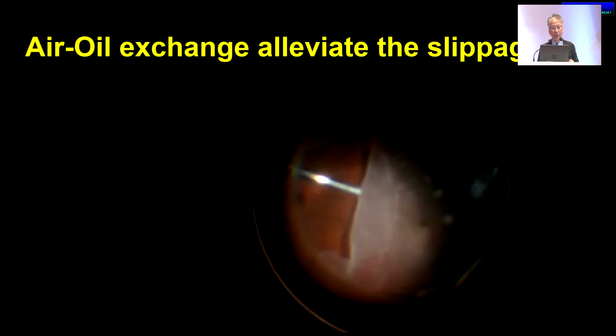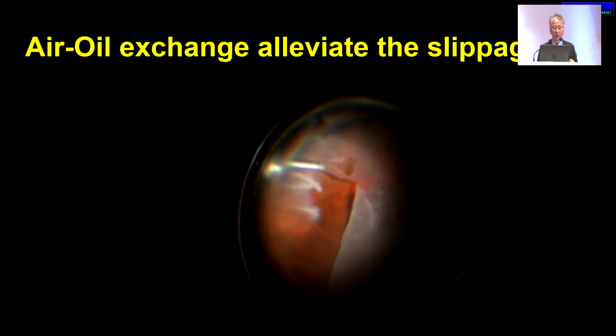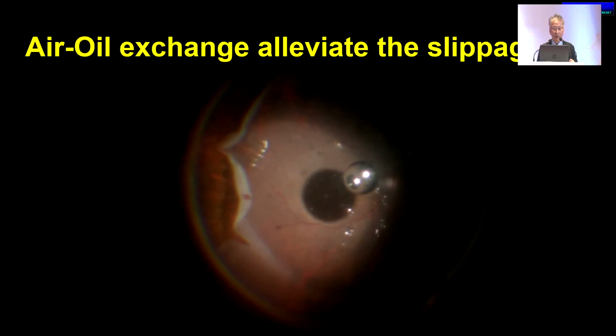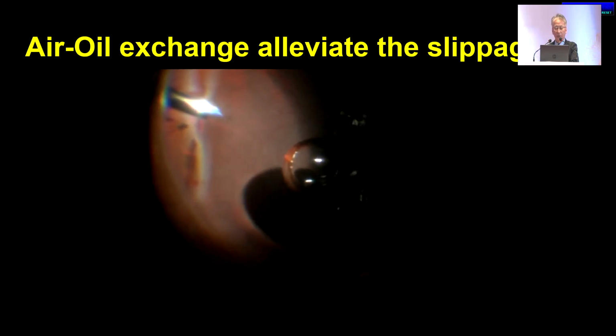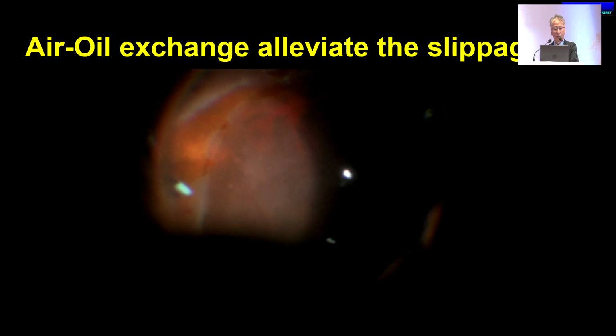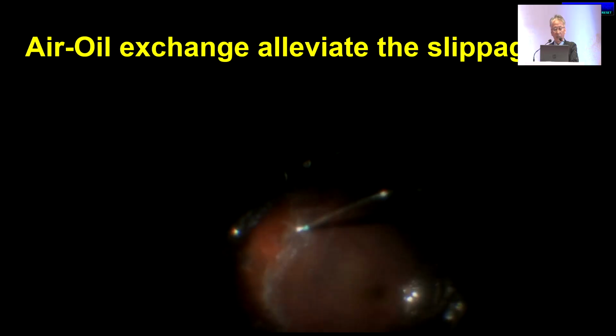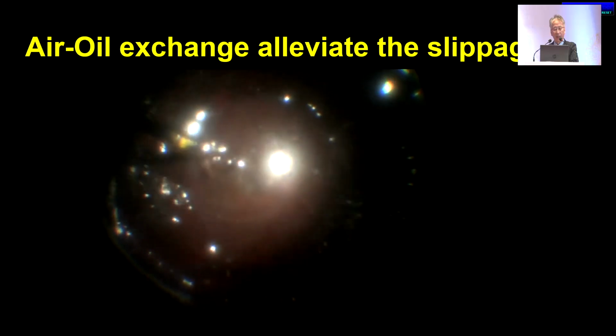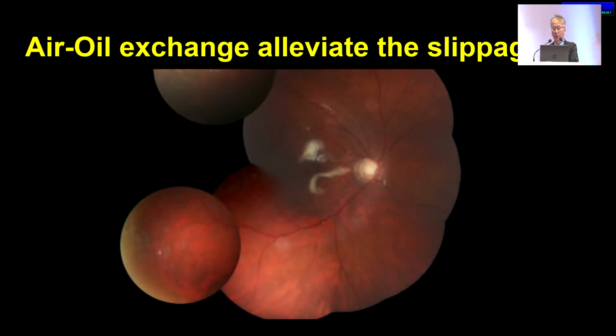The other way is that you can do this air-oil exchange to alleviate the slippage. For example, in this case, you can see that after the perfluorocarbon liquid, I tried to do this fluid-gas exchange. And you can tell that during this exchange, even though I very carefully drained the subretinal fluid, there's still a fold over the area. In this case, I changed to silicone oil, and then the fold became less.